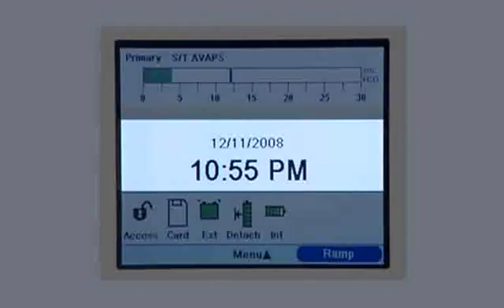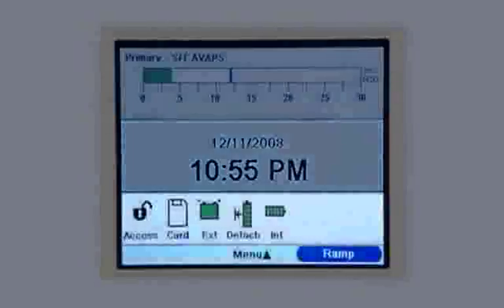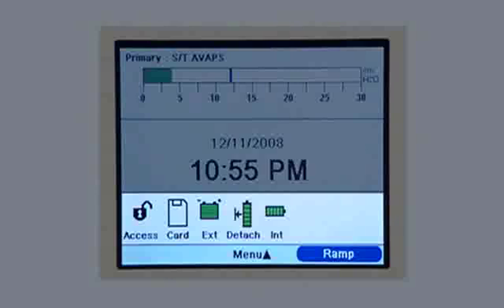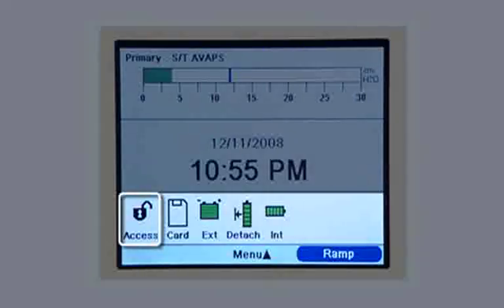In the center of the screen, the current date and time is displayed. The status panel at the bottom of the screen displays informational symbols. You may see an open lock, which is a feature used by your home care provider.